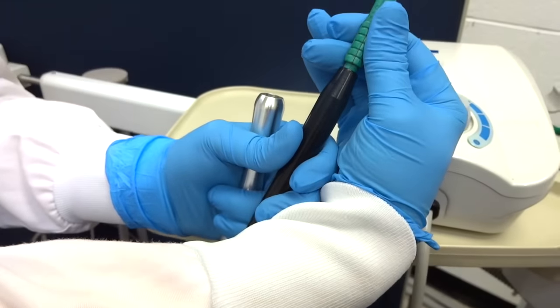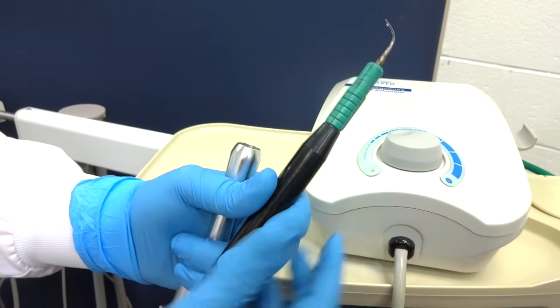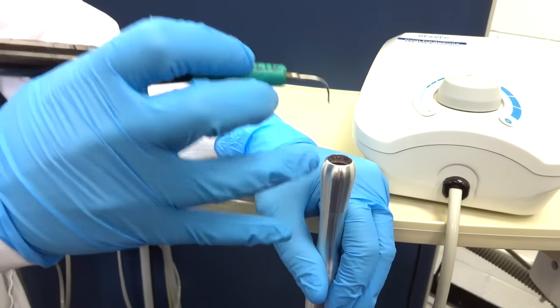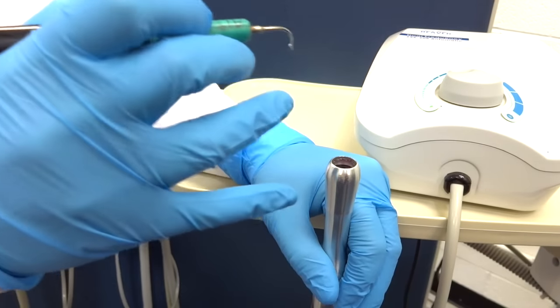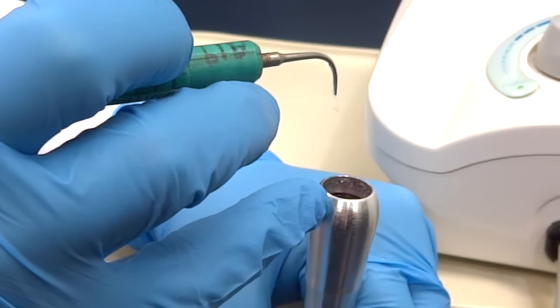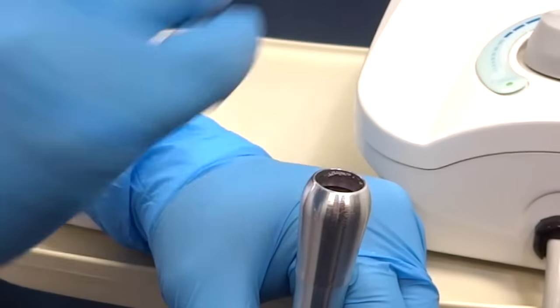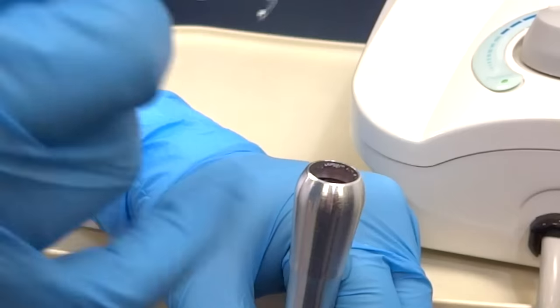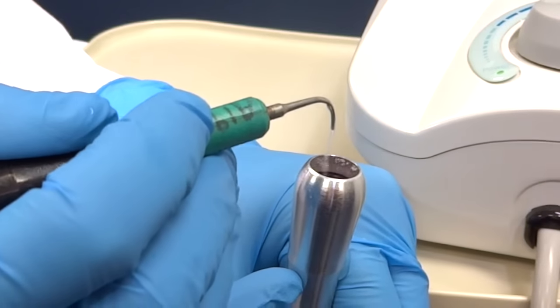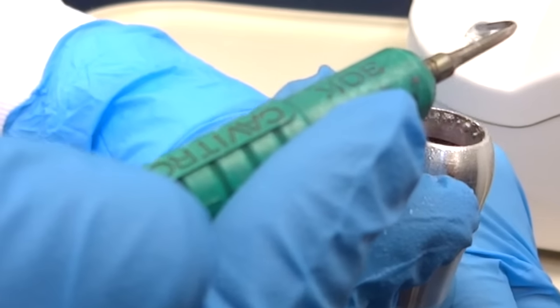You're going to settle the ultrasonic tip in the handle. What you're looking for to know that your ultrasonic is at the right amount of water is a fine mist and a drip. I'm just going to engage the foot pedal over my high speed — as you can see, that's just one sharp stream of water. So I'm going to adjust my dial and wait for a mist and a drip. There's a nice mist and a drip — that's what you're looking for.